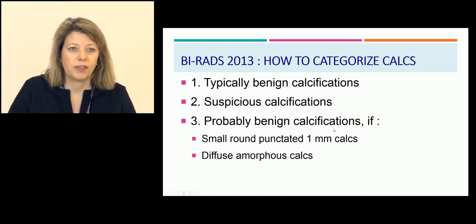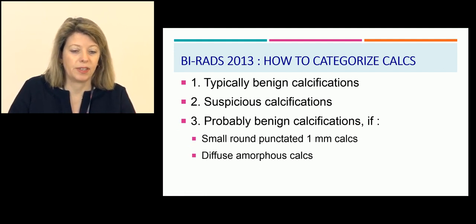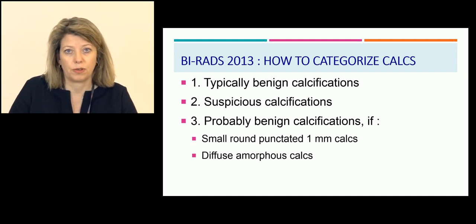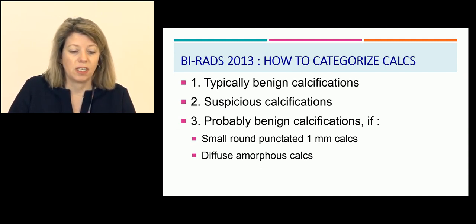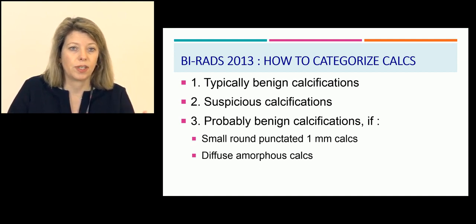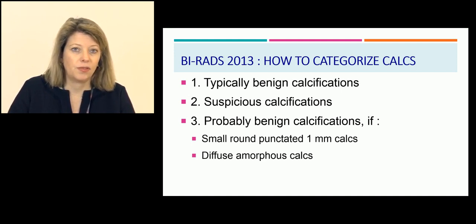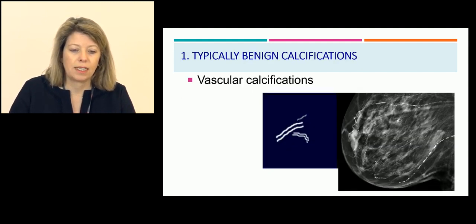In the new BI-RADS classification, it's quite simple — there are essentially two categories: typically benign calcifications and suspicious calcifications. The only categories for probably benign calcifications include small round punctated calcifications under 1 mm, and diffuse amorphous calcifications. Let's see some examples of typically benign calcifications.